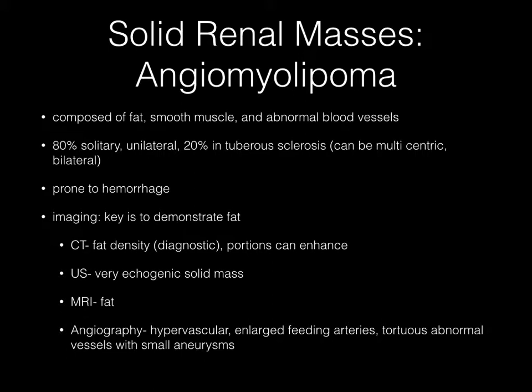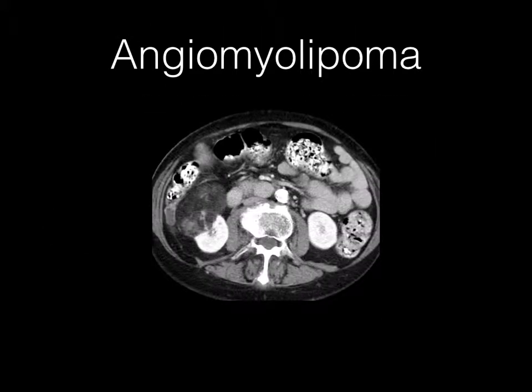On ultrasound, you see a very echogenic solid mass. MRI demonstrates fat. Angiography shows a hypervascular enlarged feeding artery or arteries and tortuous abnormal vessels with small aneurysms. Here is a prime example of an angiomyolipoma involving the right kidney with some elements of enhancement, but the lesion itself does obviously demonstrate macroscopic fat.